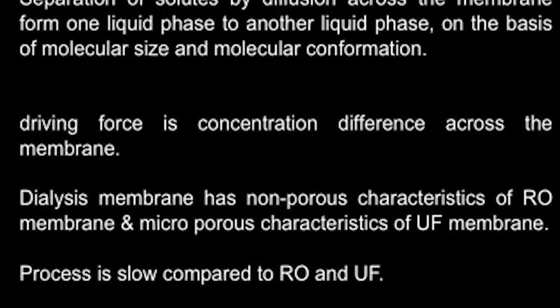The separation of solutes generally happens because of diffusion across the membrane from one liquid phase to another. So it is based on the concentration difference. The blood has a very high concentration of all these salts and your dialysate has a very low concentration of them. So the driving force is your concentration difference.